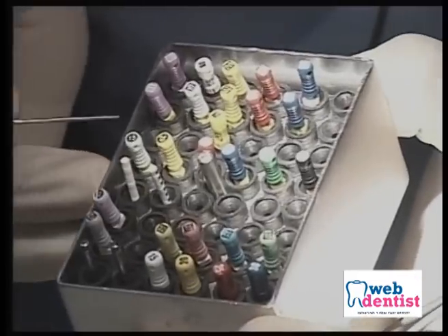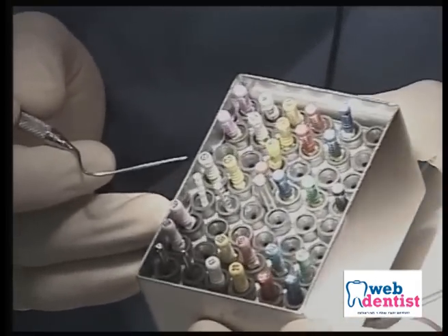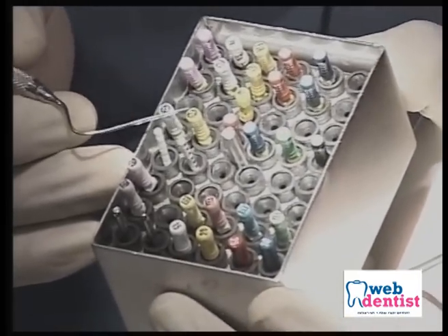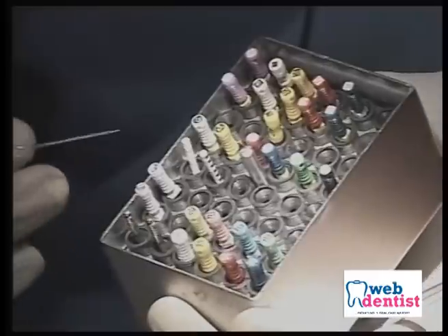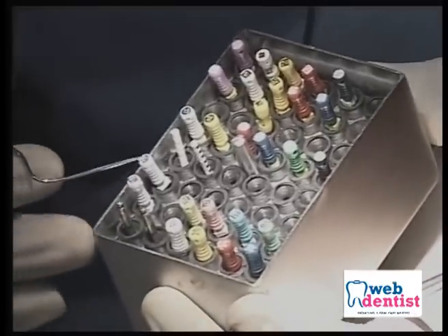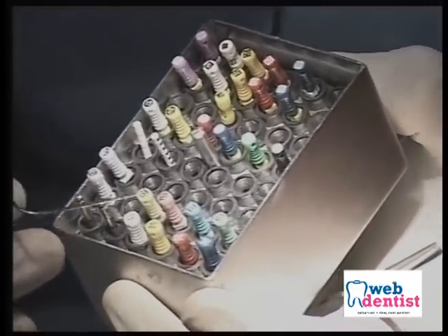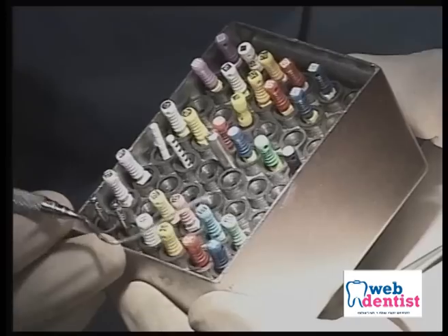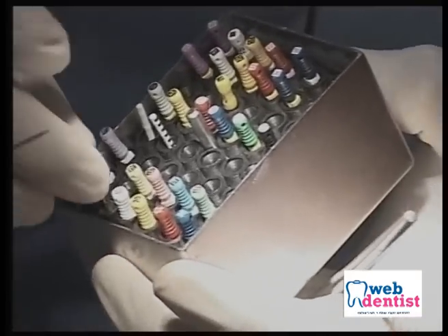They are always used in a filing motion, and K files are used in filing and reaming motion. You are not supposed to rotate H files in the canal, only then will they bend. Otherwise, they are fantastic instruments to use. Then I have some other instruments like the D-finder. And there are some instruments which you get in 12, 17, 22, 27, 32, 37. These are the odd sizes, the sizes in between. You should always try and have them in your kit.